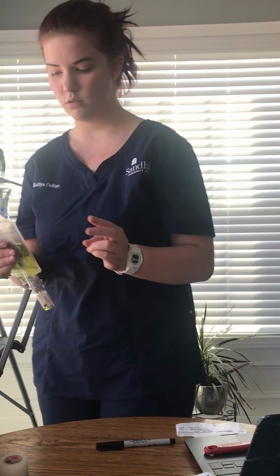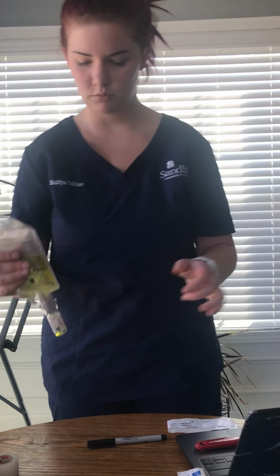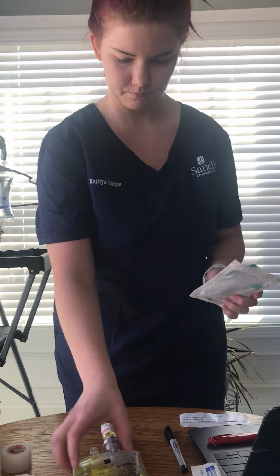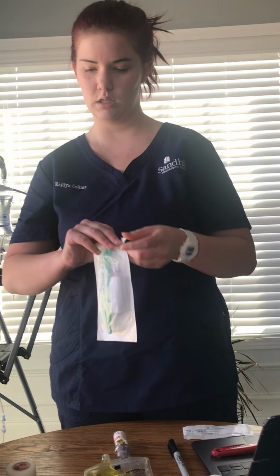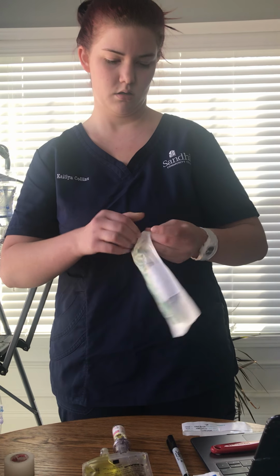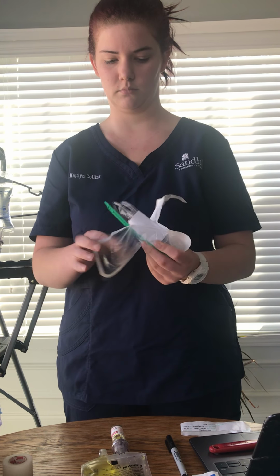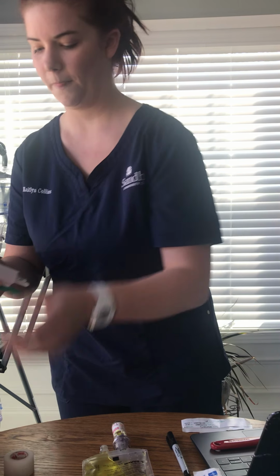All right, so now I'm going to open my secondary line here. Don't need that plug yet.